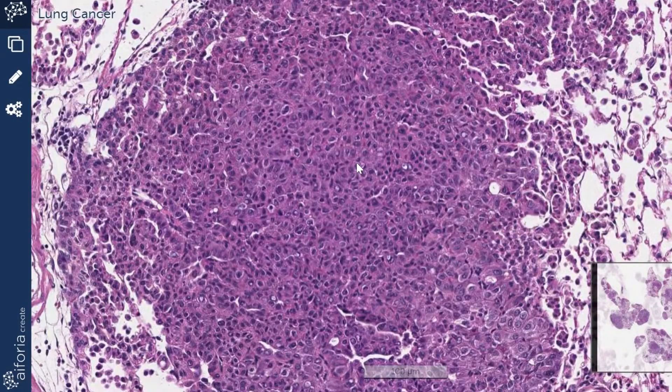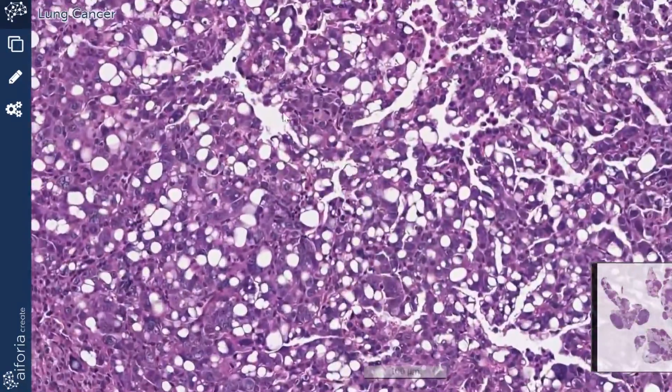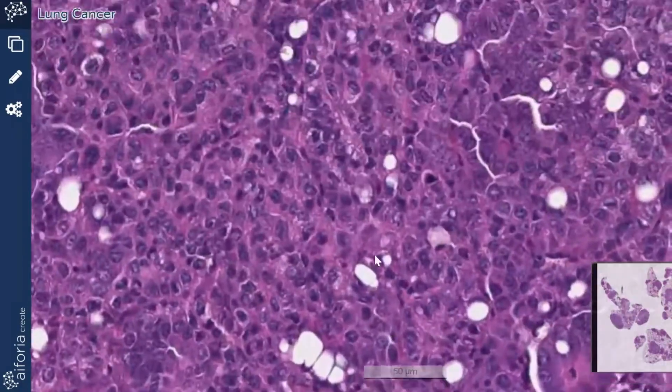Step number two: start annotating. We're going to start annotating what we just took screenshots of, beginning with the main appearance of the tumor cells. But as we start annotating, we're going to realize some of the cells look different — slightly different here and slightly different there. So take more screenshots and add more descriptions, adding them all to your initial ground truth document. In that way we cover the full spectrum of what we will be annotating.